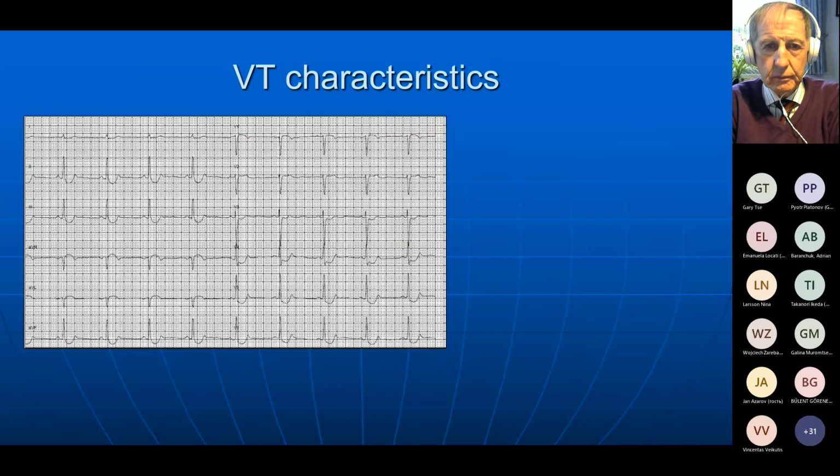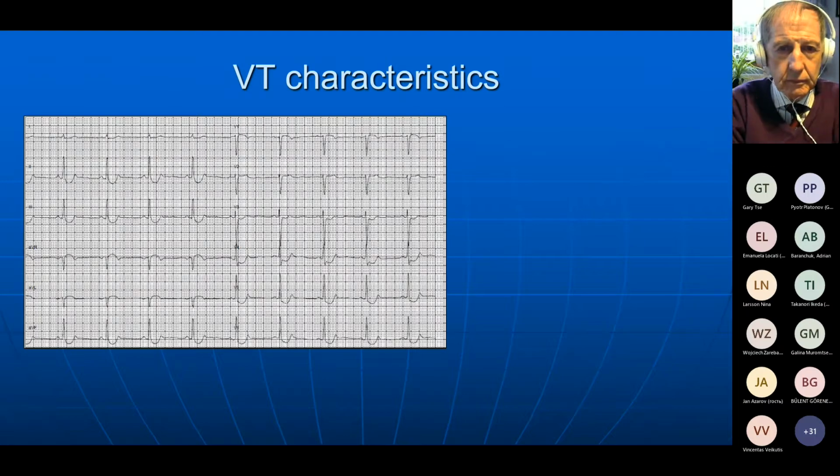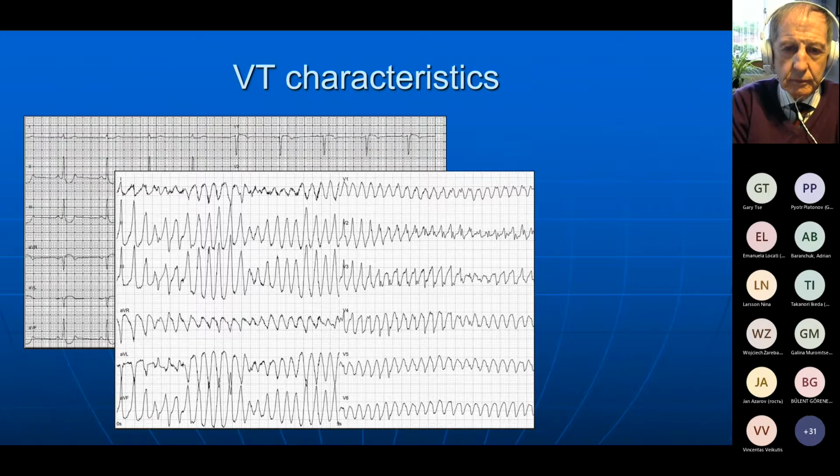So what about the ventricular arrhythmias? Obviously, that's a clinical hallmark of this syndrome, and it's of major importance for clinical handling of these patients. Do we have any data there? Yes, we have a bit of data here. And here is a sinus rhythm ECG of a patient with pronounced ST depressions. And this same individual developed ventricular tachycardia. And what really characterized this was it was fast and polymorphic.